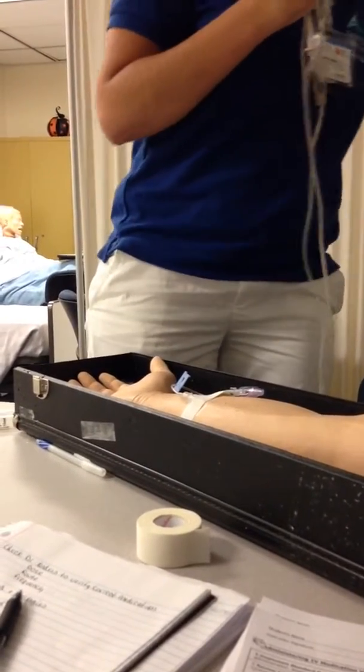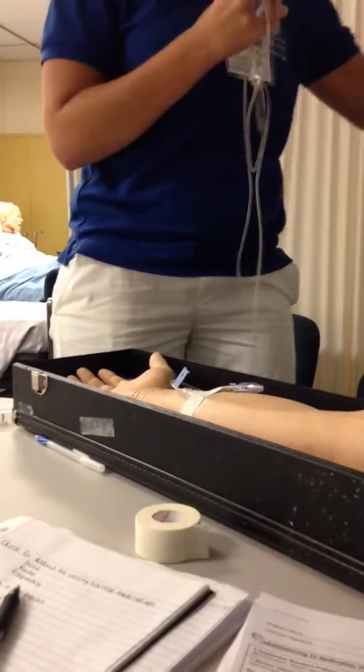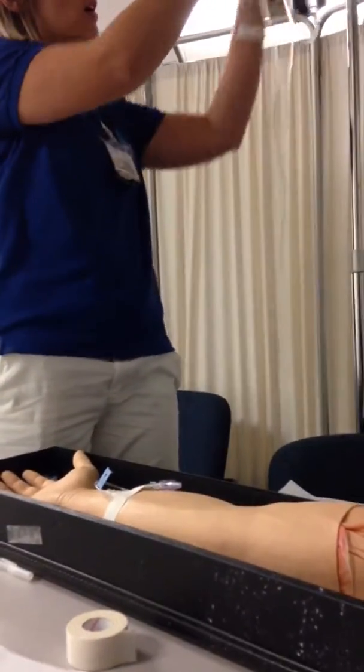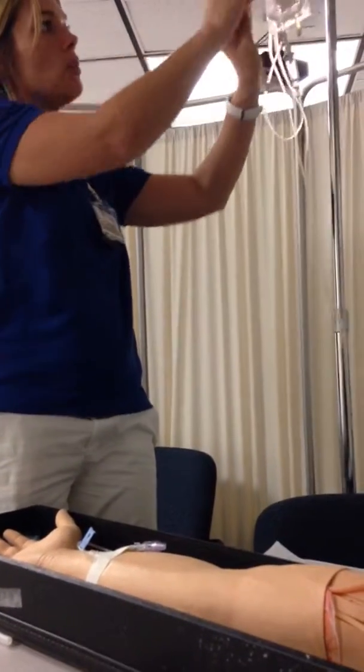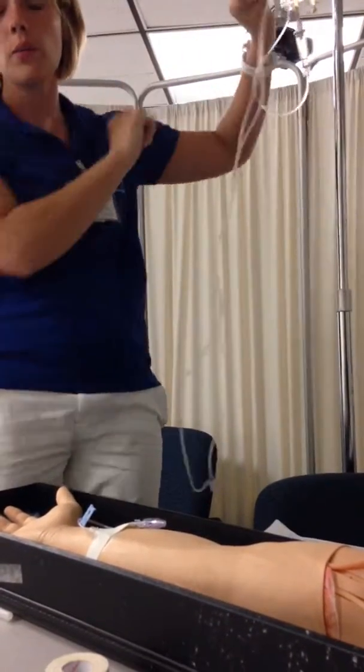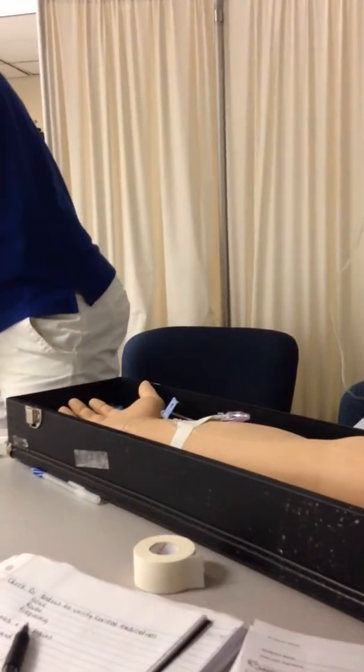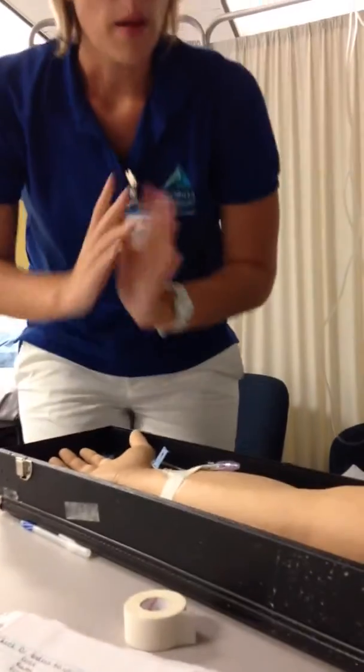I'm going to hang it up here. While I'm holding this, I'm going to hang this. This is still sterile because I have not removed my cap yet. I'm going to wash my hands, apply my gloves, and aspirate. And I see blood.